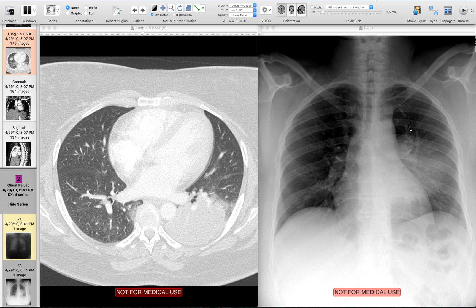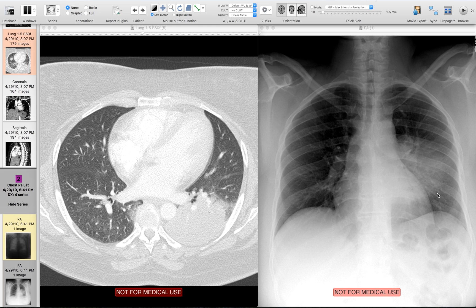This is the example I showed in class. We have an opacity in the left lung and we want to determine whether it is in the left upper lobe or the left lower lobe. From the silhouette sign and lobar anatomy, we can figure it out. This opacity is superimposed over the heart but does not obscure the left heart border. Since the left heart border is immediately adjacent to the lingula and we can see that border clearly, this opacity must be in the left lower lobe and not in the lingula.